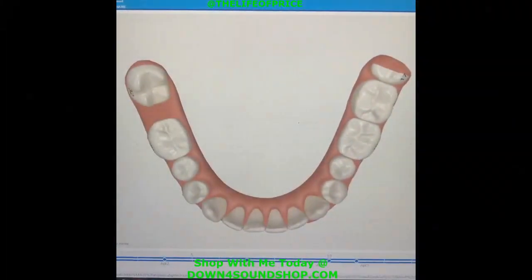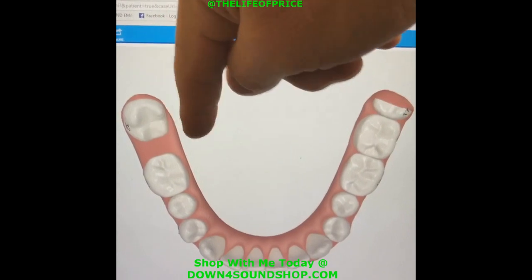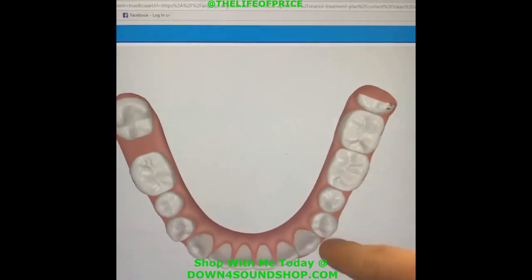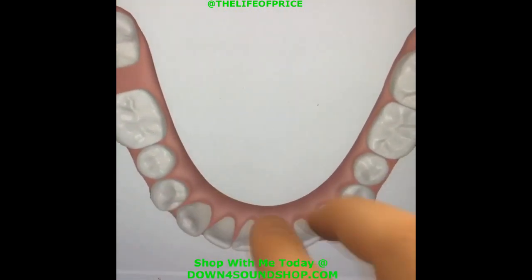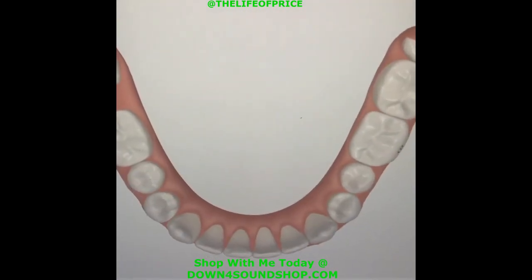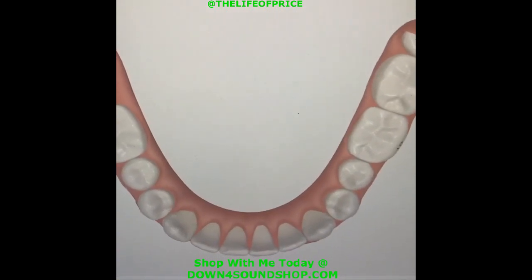Another update on getting my teeth fixed. This is my Invisalign projected results. These are my bottom teeth. I'm obviously missing one on the bottom right, overcrowding here, overcrowding here. So these teeth will almost have to rotate 180 degrees, and my jaw will have to be widened, starting like this, ending like that. You can see if I slide it back and forth how they're changing.